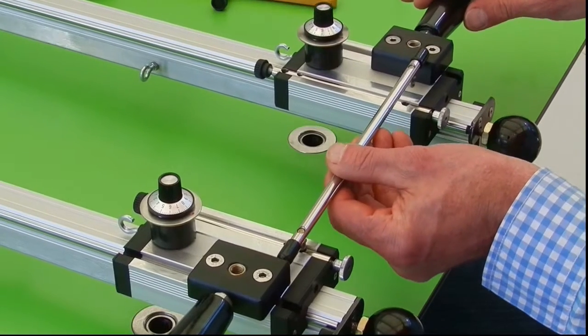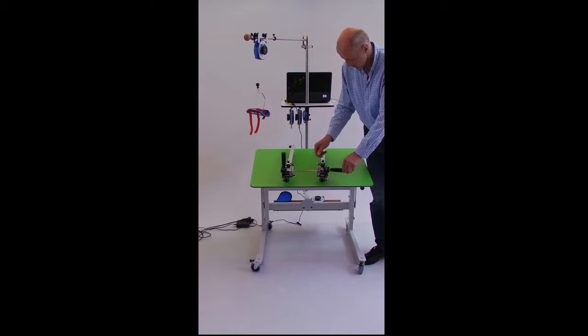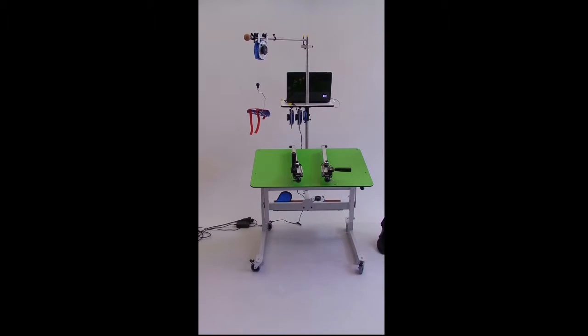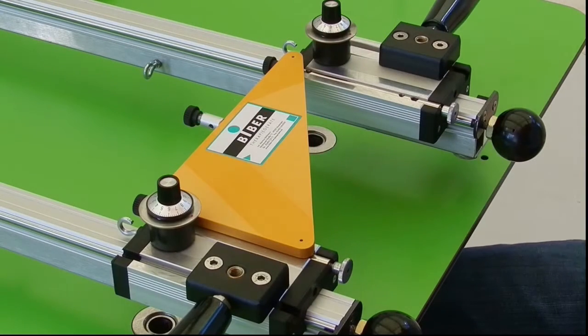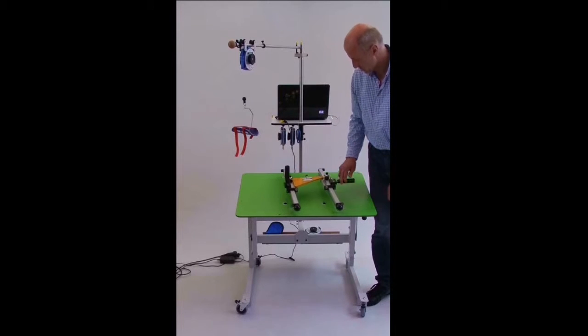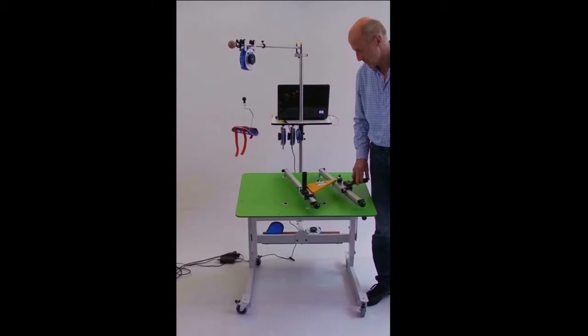With the help of a connecting rod, the swivel arms are connected for bilateral exercises. The yellow triangle allows a parallel movement of the swivel arms together with the sledges. Hereby, 2-dimensional movements are possible.